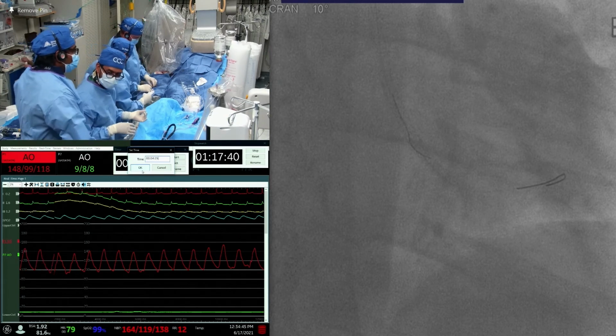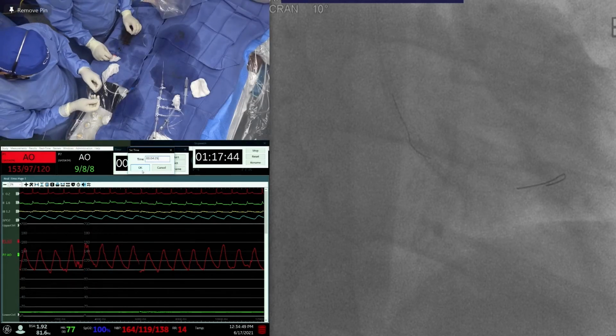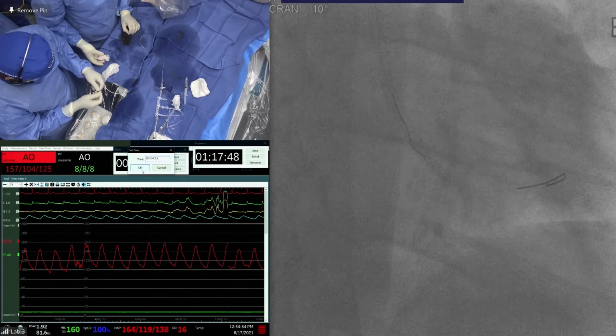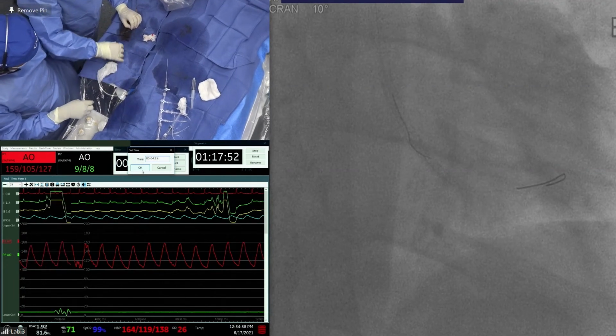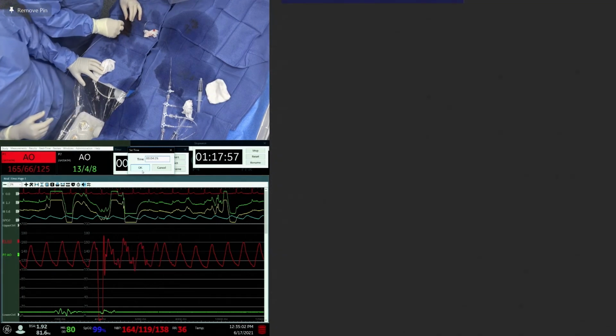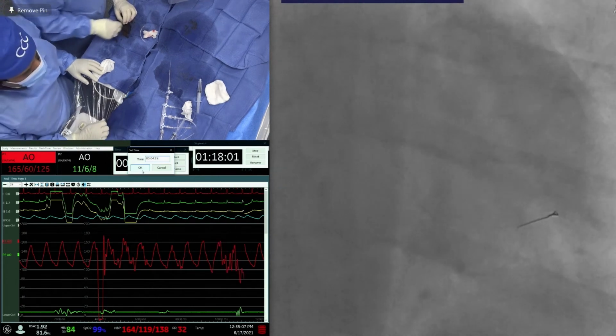The other comment that I had, if you have two layers of stent, it is going to be much more difficult to open an underexpanded stent. But brachytherapy to me, for DES restenosis, is the first line. How many on this panel are using brachytherapy for these ISR cases until we get drug-coated balloons? Dr. O'Neill? And are you impressed with your results? It's too early to tell.